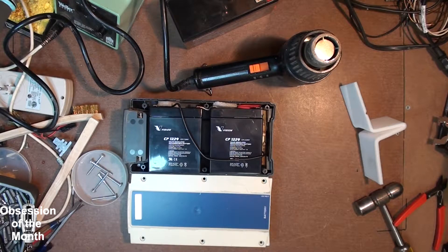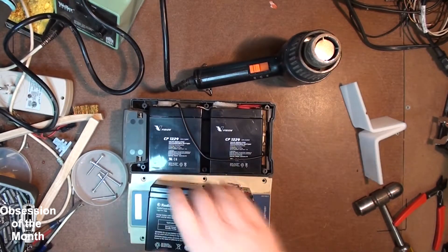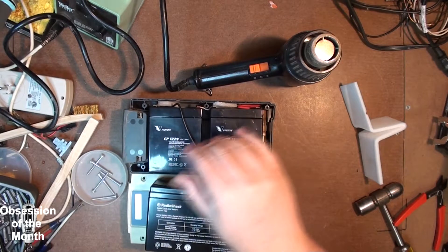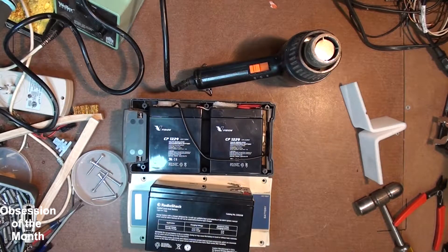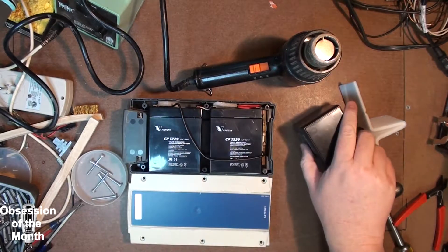I'm not even going to do that at this time. I'm probably going to take a couple of these, wire them in series, and possibly make a little tray to put them on the side of the lift and wire them in. But I may order batteries at a later time anyway, just to make it a little more portable.